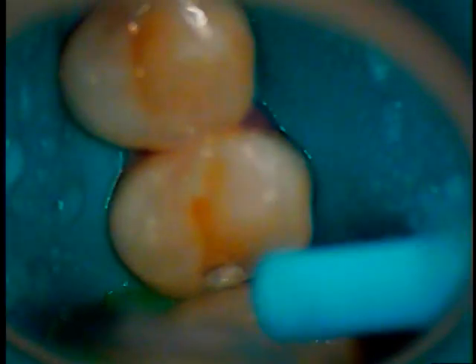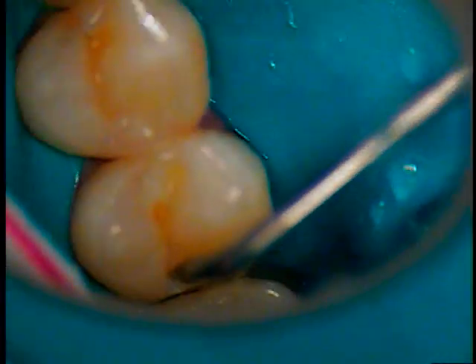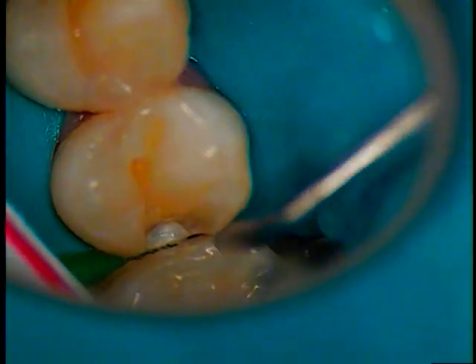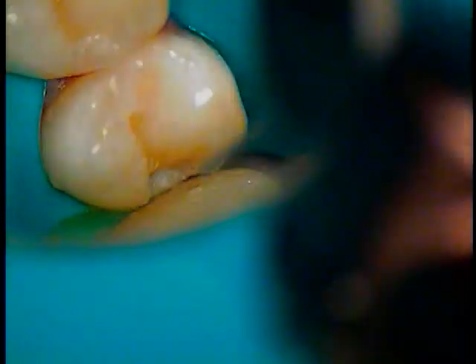So everybody says, well, let's treat it with fluoride. Well, I think once it reaches this point, you have to fill it. Okay, here's my condenser. My action's going to be laterally up against this wall and this wall when I go to condense. So I'm just focusing more on a line angle now, internal rounded line angle, keeping everything smooth.